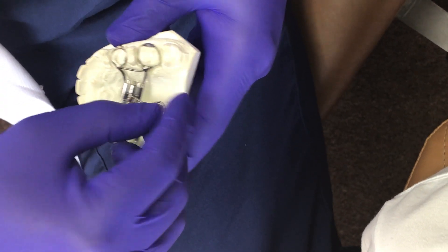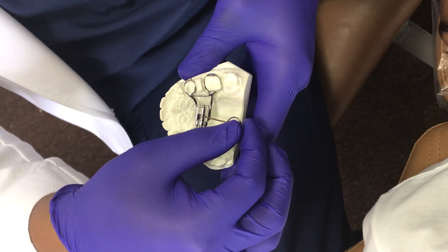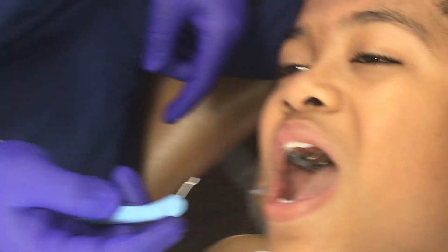You have to continue to spin it, so each time you activate it you always want to see the next hole. Okay, so what that's going to look like in the mouth — tip your head back for me.